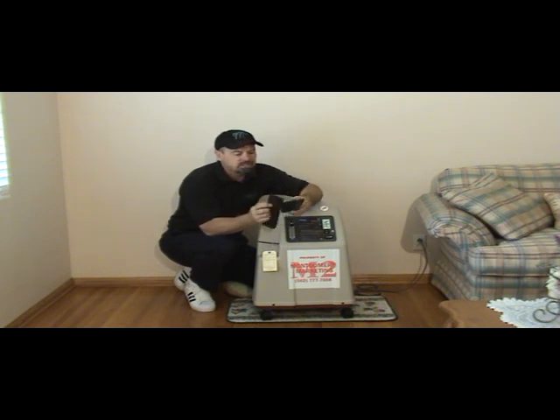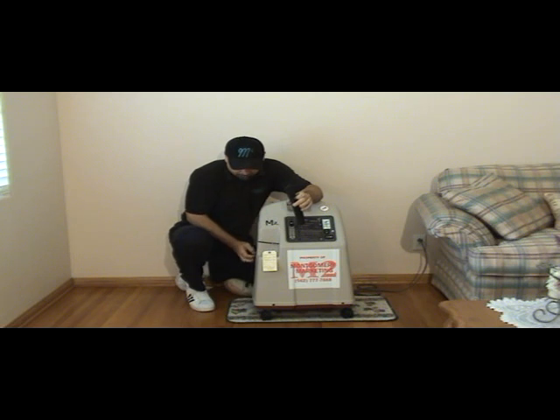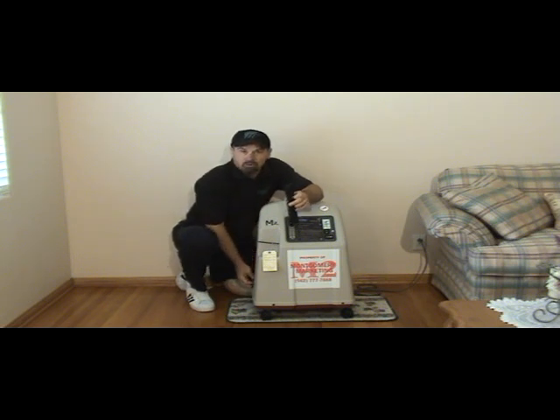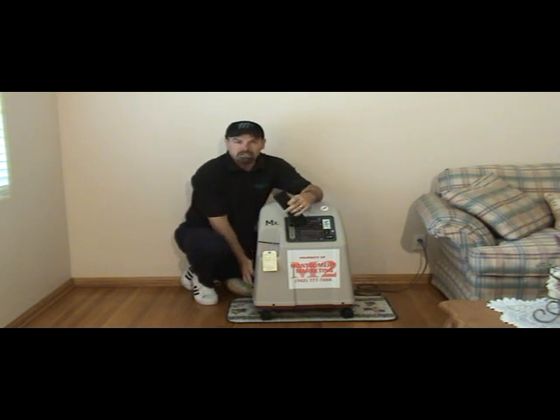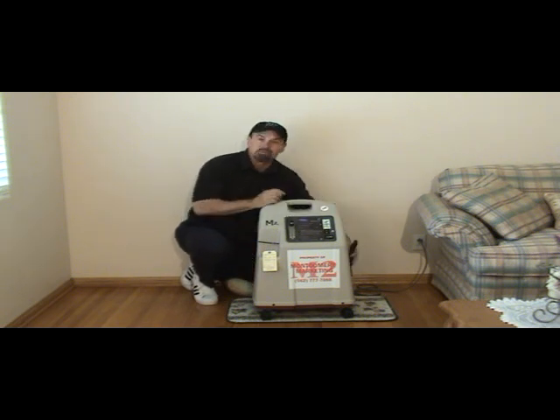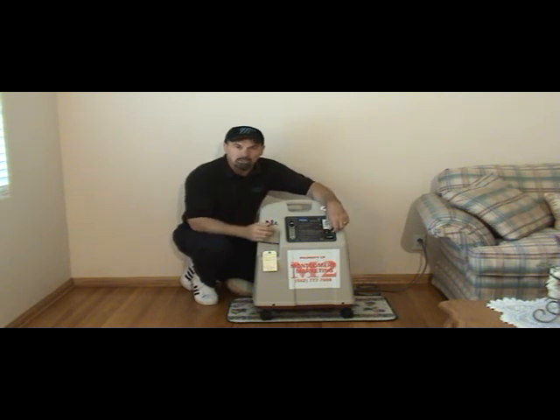So my suggestion is just to take it outside, rub them together until you can see through it, you see most of the lint is off, then just bring it back and fit it back in the way it was before. I don't like to use soap and water or any detergent to clean these units because I don't like to advise people to use any type of moisture with an electrical device. Even though the risk of electrocution is minimal, anytime we can eliminate that even more, that's what we're going to do. So don't use any water to wipe it off.